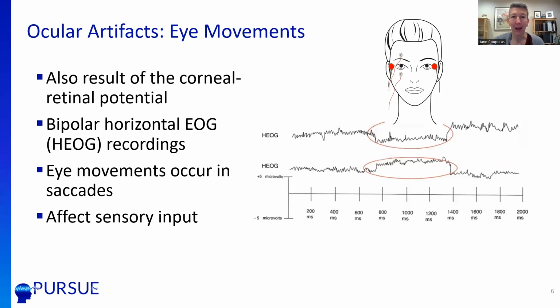We also have eye movements from left to right. These are also a result of the corneal retinal potential. And we can look at these using bipolar HEOG recordings. When we move our eyes, we're doing saccades. We're not actually getting visual data in the system, so we care about those. It affects our sensory input, and they look like little box cars is the way I think about them. So they're recording from both sides of the eye, and what happens is when one side goes down, the other side goes up. And so we can easily recognize these by that kind of difference in activity in these box shapes that we'll see in our data.